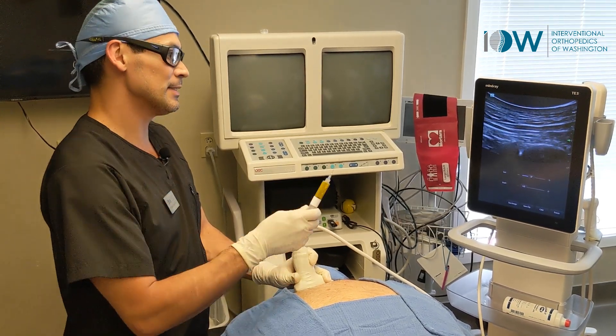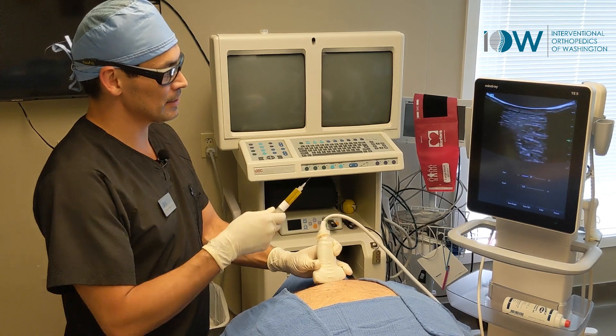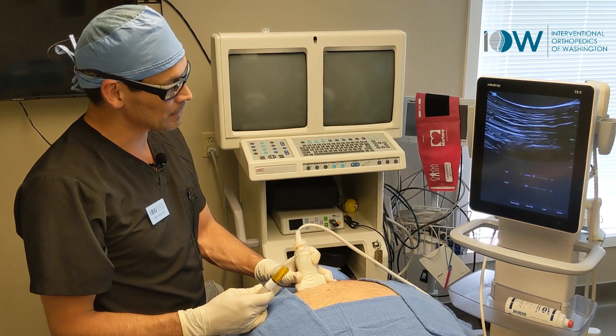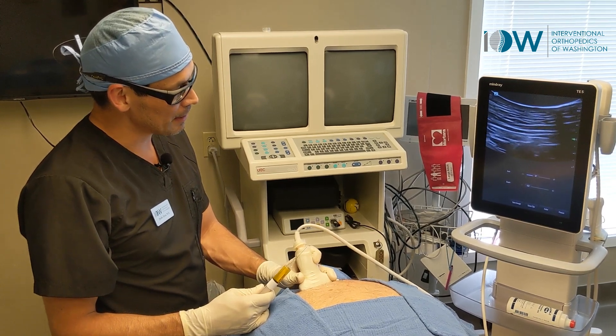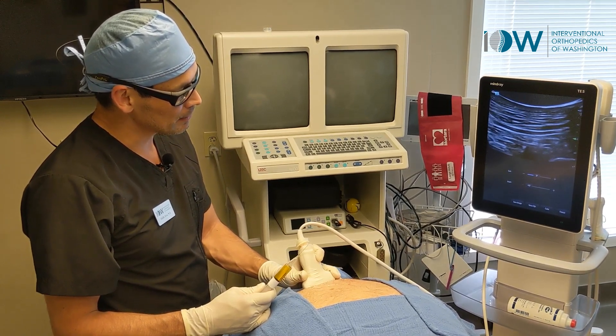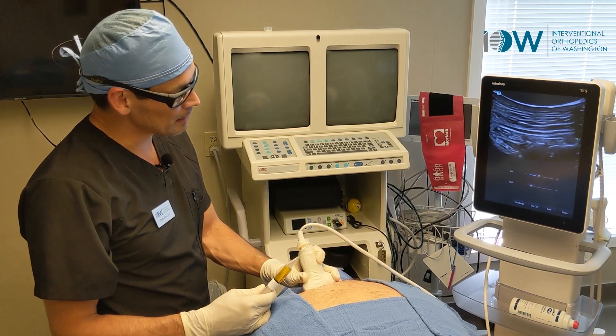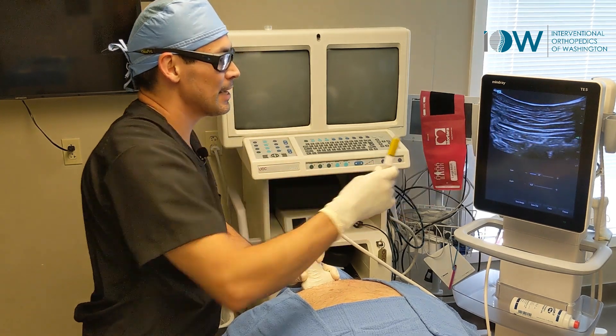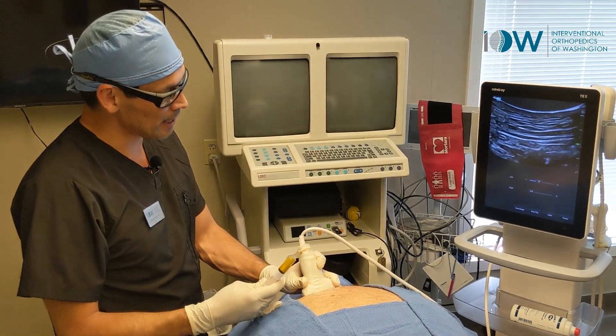Starting at the center of the spine, we have a spinous process. Going lateral to that, we start to see a rib, and at that rib there is a vertebral and rib facet joint where we're going to treat.